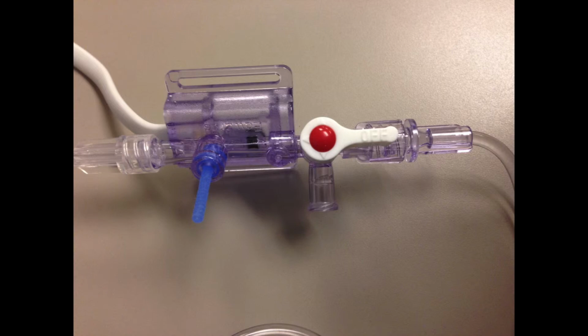So whenever the patient's position is changed, if they're sat up, if they're raised, lowered on the bed for any particular reason, we need to make sure that the transducer height is altered in the same manner. So if we sit the patient up, the patient's heart is going to be higher than before. We need to make sure that we raise the transducer at the same time. We should also zero the line whenever there is a movement, just to make sure that we're not going to be changing any of the outputs of the waveform.